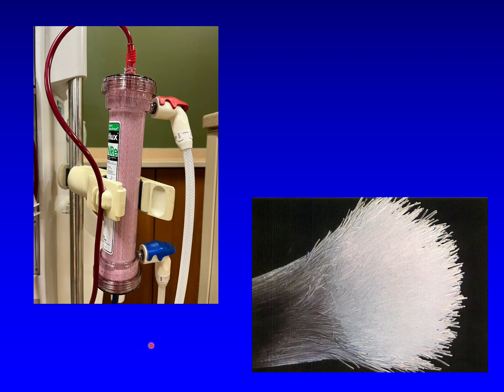Although the very first dialysis membranes were flat and about the size of a coffee table, current dialyzers achieve more surface area in a compact space by being made in the form of capillary-like hollow fibers with fenestrations along their entire length. The patient's blood flows through the capillaries, of which there are about 10,000 contained in an airtight cartridge. Dialysate solution flows through the cartridge, but outside the fibers, picking up the bad stuff by diffusion and carrying it away.